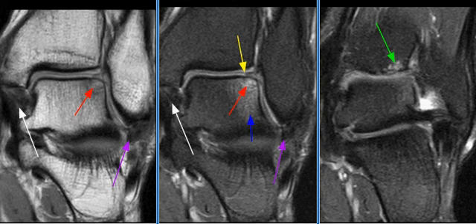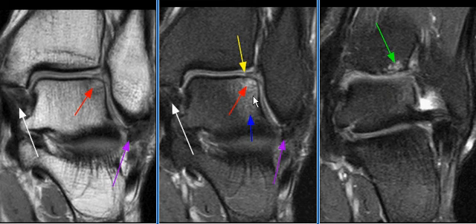MRI examination of the ankle shows an osteochondral lesion of the talar dome, laterally, with overlying cartilage fissure, as seen on this image with a yellow arrow. There is associated perilesional edema.